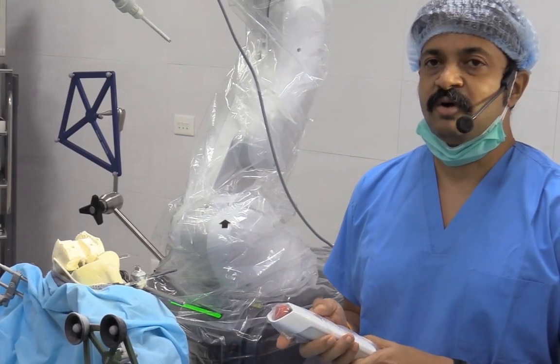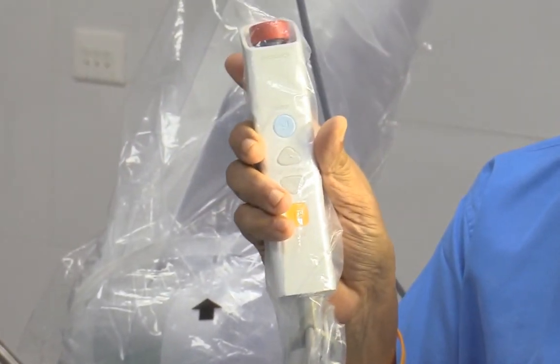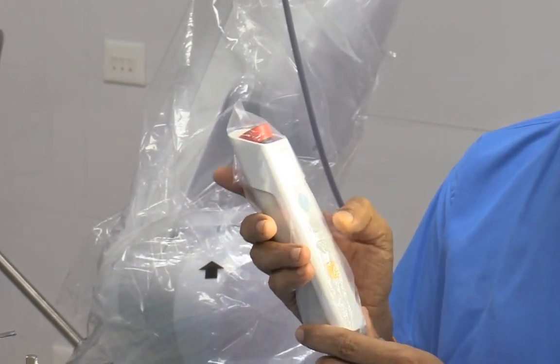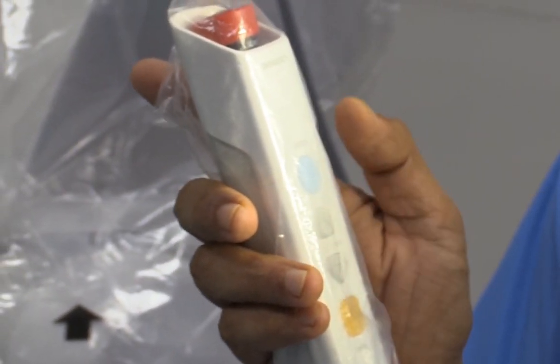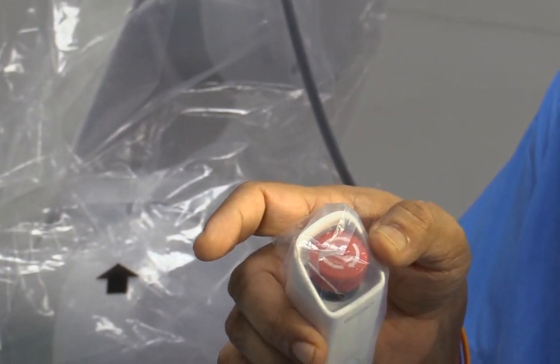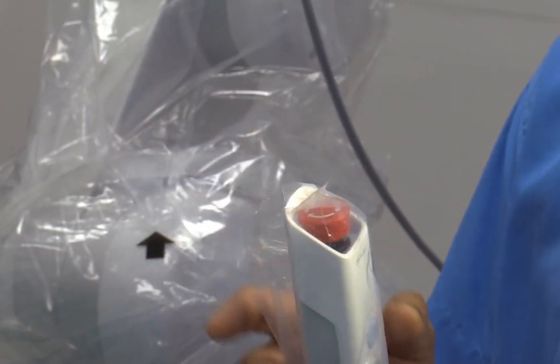Not to wonder what was really the magic tool in my hand, this is what I was using. And as you can see, this will be given in a sterile pouch, and it just has got an enter button, up and down key to increase or decrease the speed, or even to change the menus on the screen if need be. And there's a pause button, and here right is the emergency stop button. In case you see that something is not going right and you want to quickly stop, you can always do that.